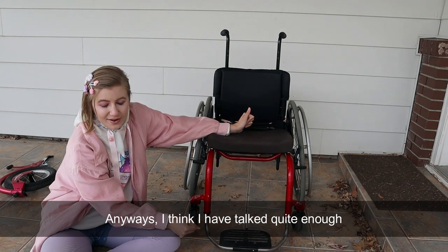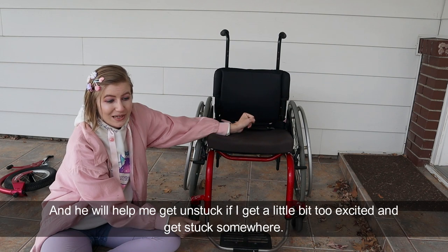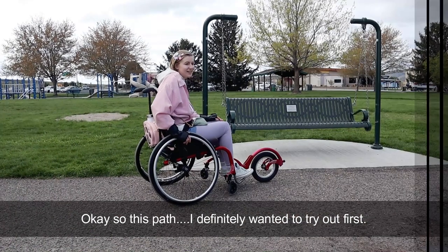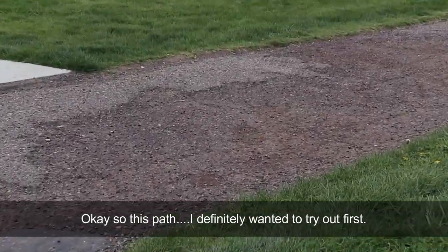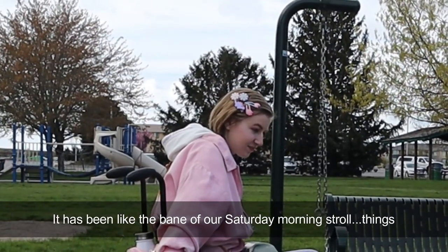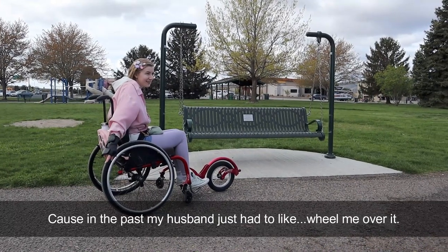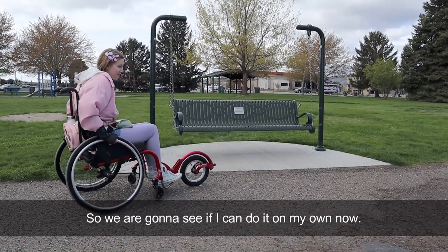Anyways, I think I have talked quite enough, so we're going to head out to the park. My husband will be playing cameraman and he will help me get unstuck if I get a little too excited and get stuck somewhere. So this path — I definitely wanted to try out first. It has been like the bane of our Saturday morning stroll things. We're going to see if I can get over it by myself with the freewheel, because in the past my husband just had to wheel me over it. So we're going to see if I can do it on my own now.